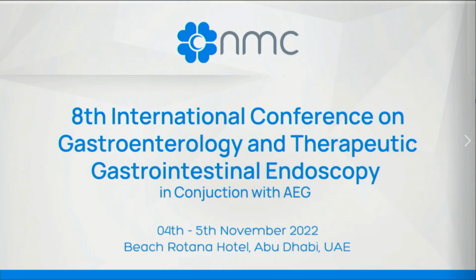Do you recommend supine or prone position? Very good question. Traditionally, I prefer the patient to be in a prone position. It creates a little bit of tension just before, because the patients are going to be intubated, at least in our hospital, and I believe in most of the hospitals of the private sector, patients are intubated by the anesthetist. So then it requires a kind of teamwork in order to move the patient into the prone position from the supine position, which is the intubation. And if the patient weighs 150 kilos, it is a challenging job.